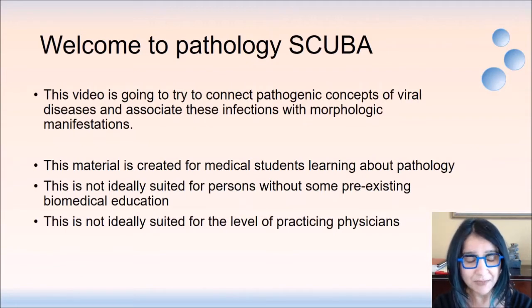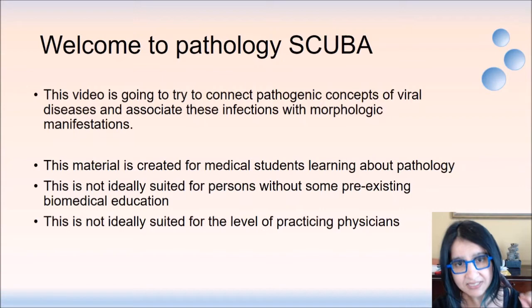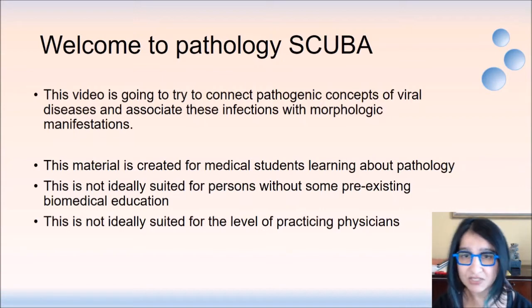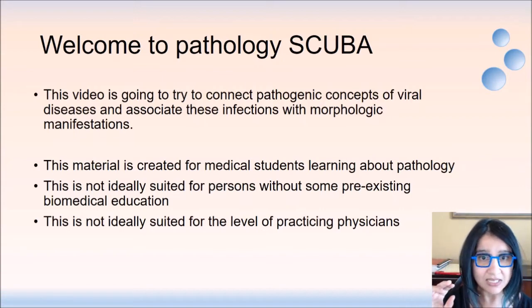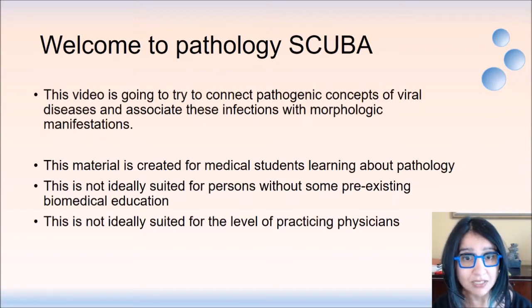But what we'll do today is we will try to talk about viral infections, and we'll talk about them both from the standpoint of classic scenarios that you might see those viral infections and tie them to the histomorphology that would help you recognize the particular virus responsible for that infection.